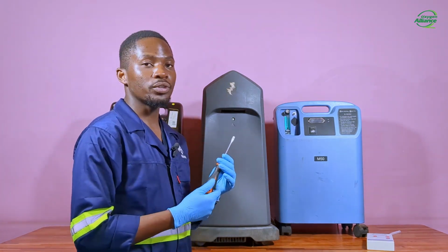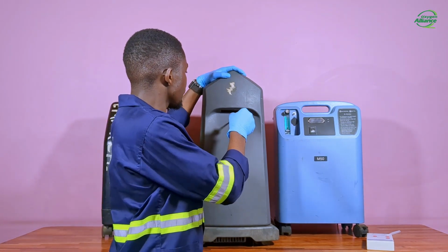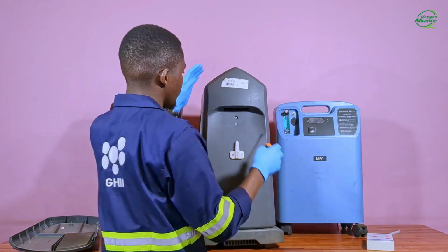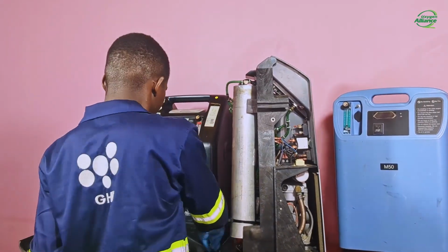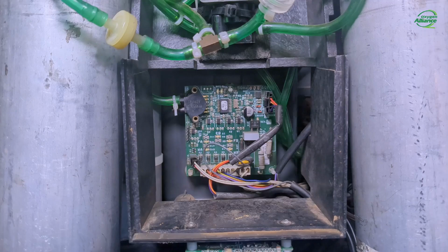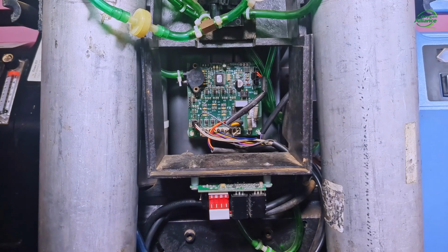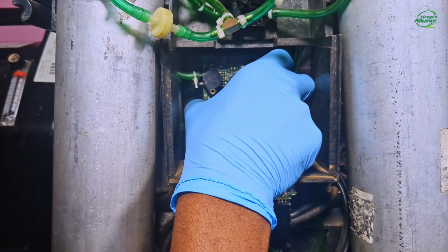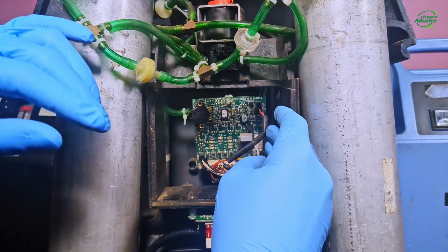I will use a flathead screwdriver to loosen the 2 screws that are holding up the covers. So this is the control board I was talking about. I'll take it out from its position so that we can observe the board closely.